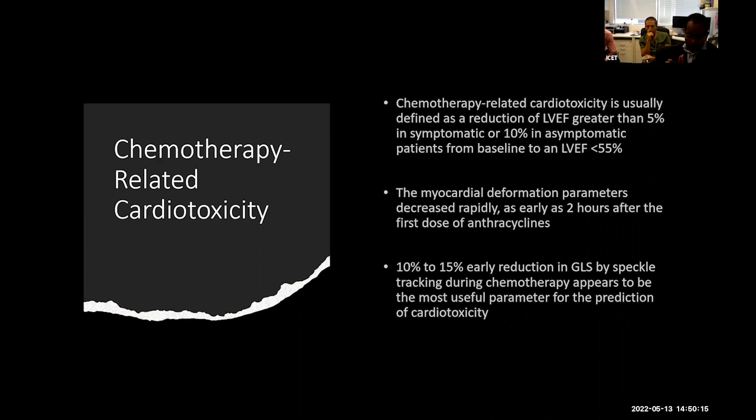One of the issues, and strain is particularly important in terms of cardio-oncology, is that the subtle changes you get early on in your myocardium as a result of the toxicity from your chemotherapy are not picked up by either visual estimation or your 2D Simpson's biplane images, because they're quite crude measurements. Strain has the advantage of picking up those subtle changes much earlier on, particularly in between the cycles, when they've had 2 or 3 or 4 cycles, that you can actually measure the subtle changes.